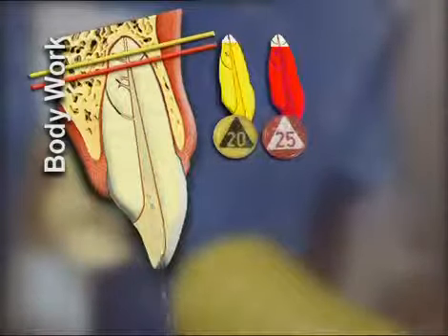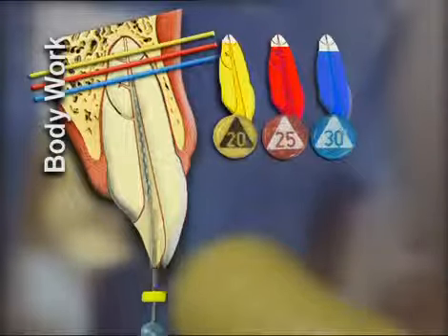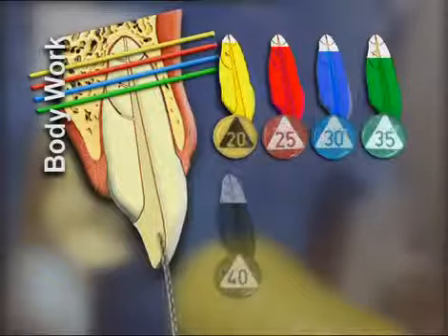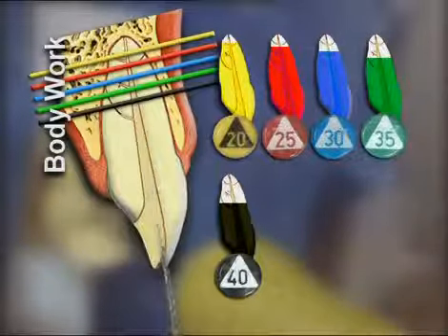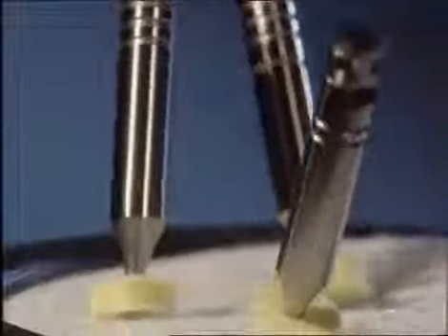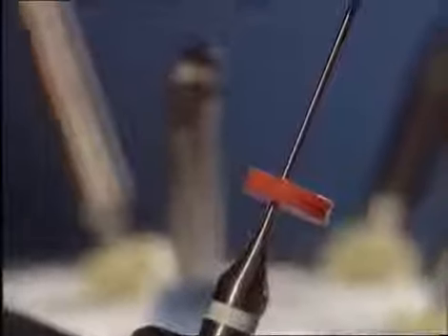The next size reamer is inserted and given half a turn when it first makes contact with the canal walls. The stop of the instrument is adjusted to this depth of penetration. This is repeated with the next size reamer, each time adjusting the stop on the instrument up to a size 40 or 50. The canal is irrigated with plenty of sodium hypochlorite.